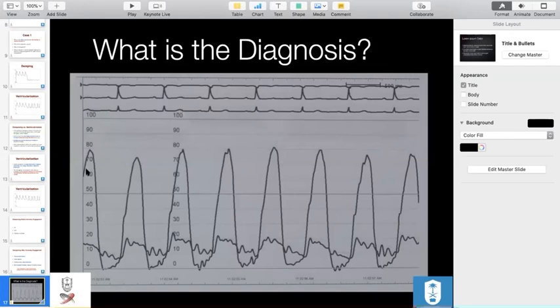Then you have two pressure tracings, okay? You have one, this wiggly pressure waveform, okay? This is reality. This is what you're going to see. And you can see here, there are a lot of artifacts. And here is another tracing that is pretty clean.